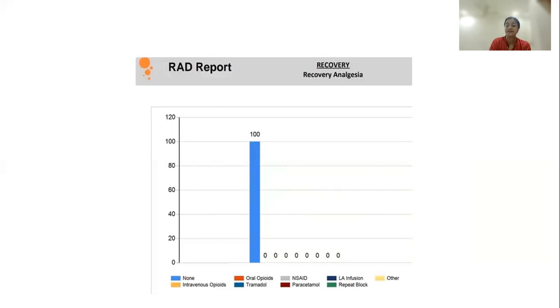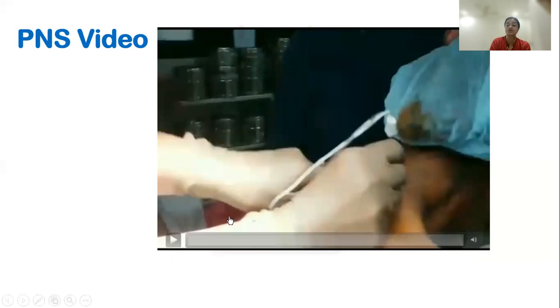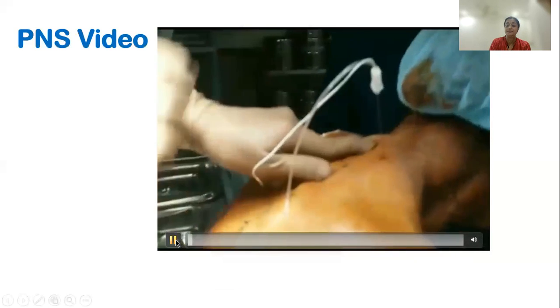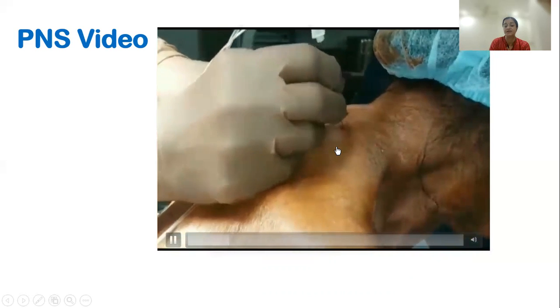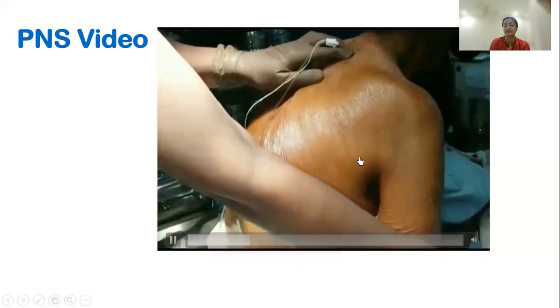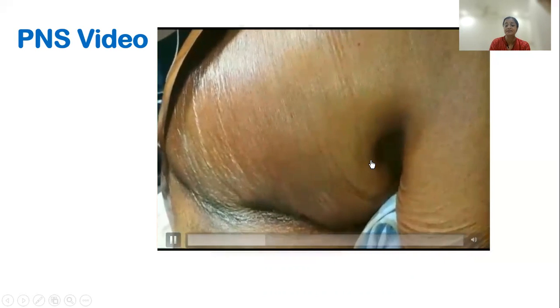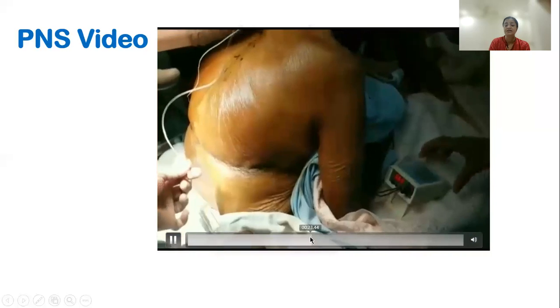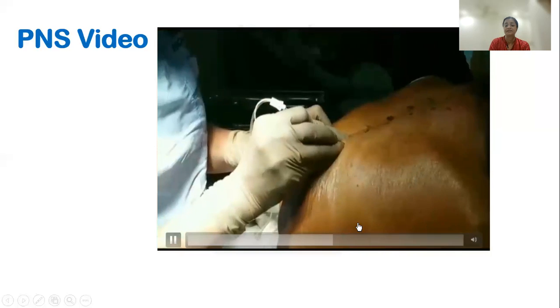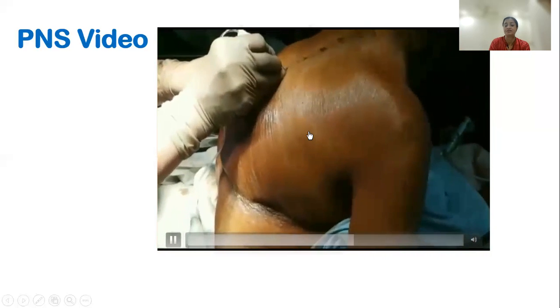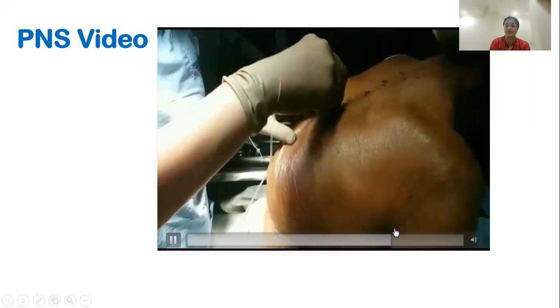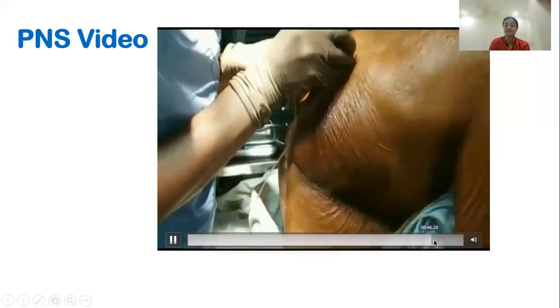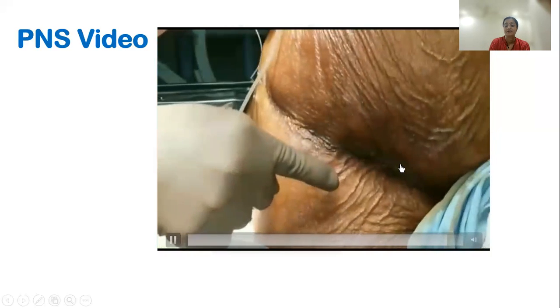This is a video showing a paravertebral block for modified radical mastectomy where the block was used at two levels. The transverse process is being hit and then the needle is walked off the transverse process caudad to get the intercostal muscle contraction. The same was repeated again at T5 — the needle was walked off the transverse process caudad to enter the paravertebral space, piercing the superior costotransverse ligament, and intercostal muscle contraction is obtained by stimulation of the dorsal rami.